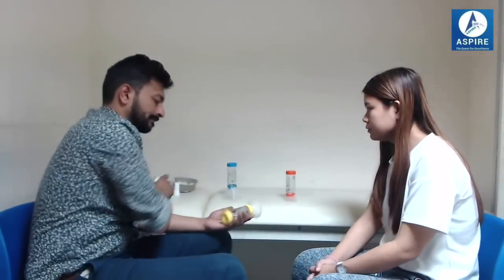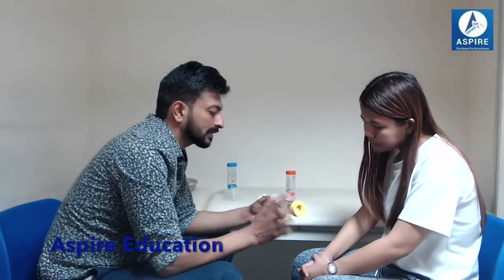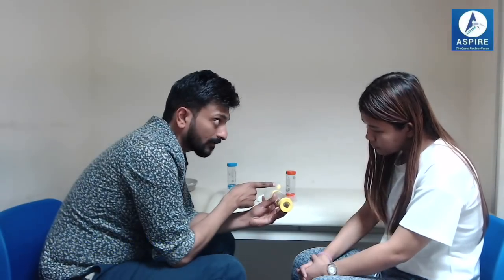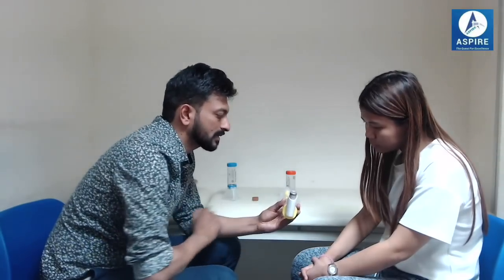Let me show you how to use it. This spacer has four parts: the mouthpiece, a valve, the aero chamber, and the inhaler port where we put our inhaler. One important thing: the valve and the point here should be in the same plane when you attach the inhaler. You shake the inhaler well, check the expiry date, and put it here like this. Make sure the inhaler and the valve are in the same plane.